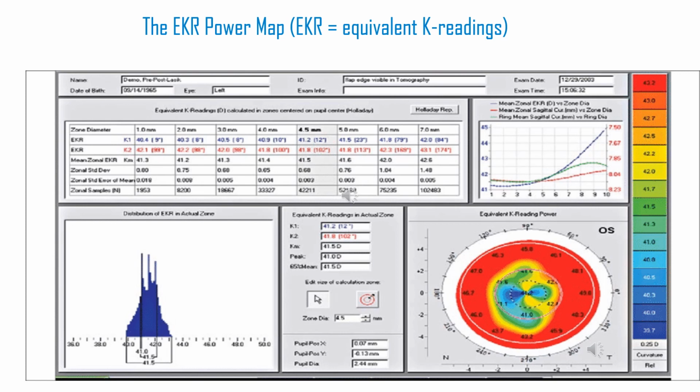Once you have this, you can input it into any IOL calculation formula. Remember, you cannot put the raw keratometry values in post-myopic Lasik patients. But you can put this corneal reading into any IOL calculation formula meant for a normal patient, because you have back-calculated it into anterior corneal surface values based on the historical corneal index, which all the formulas take, 1.3375.